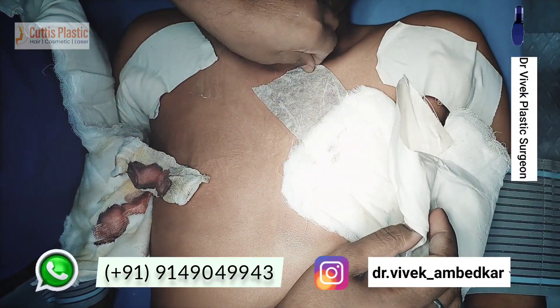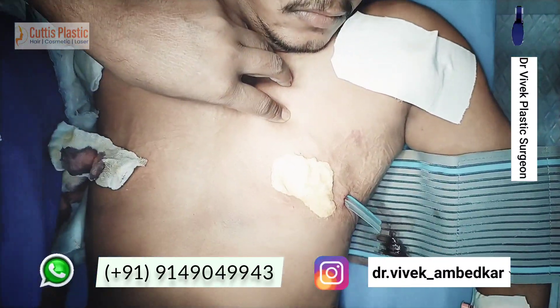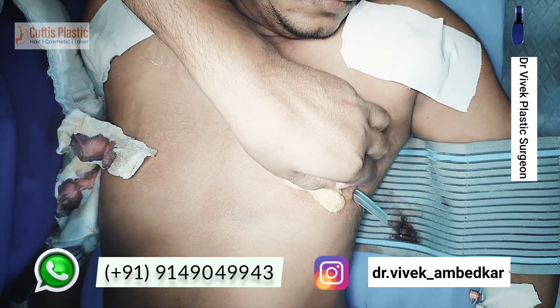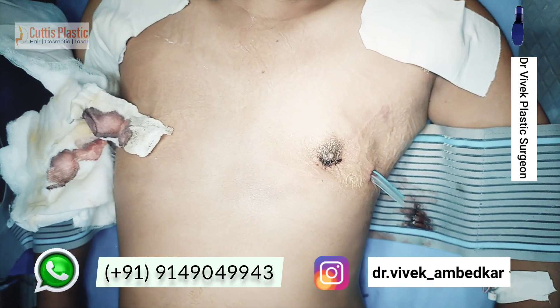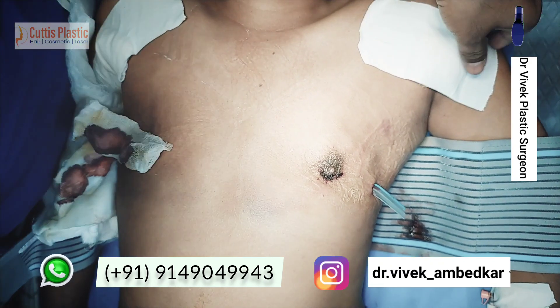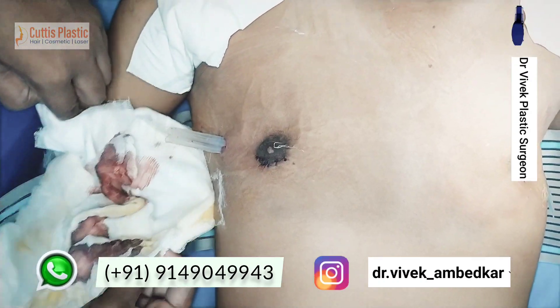You can see both sides — it has come out a little. We just want to monitor what remains inside, because if it stays inside, there remains a lot of hematoma. You can see that there is not much; it has come out a little on both sides.